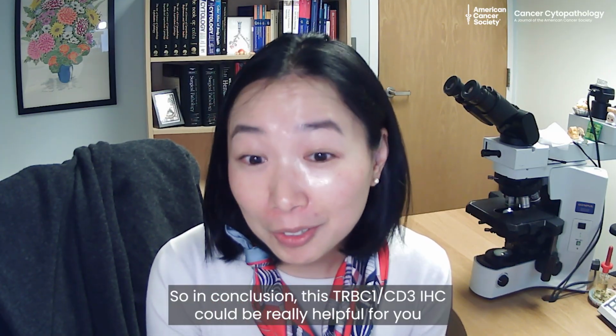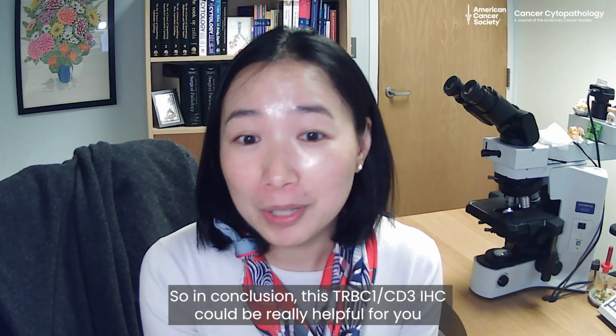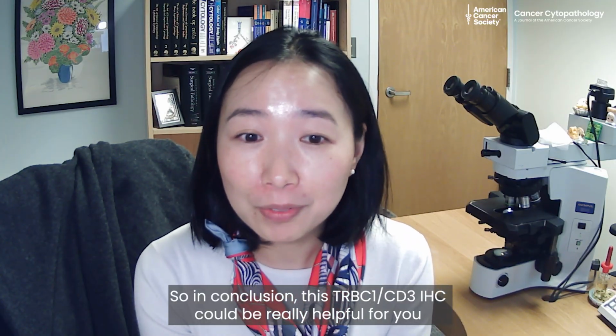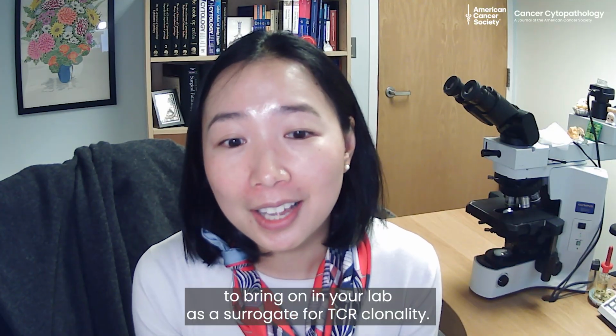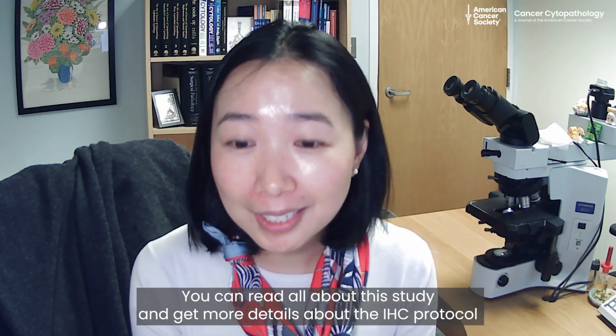So in conclusion, this TRBC1 CD3 IHC could be really helpful for you to bring on in your lab as a surrogate for TCR clonality. You can read all about this study and get more details about the IHC protocol in our publication on the Cancer Cytopathology website.